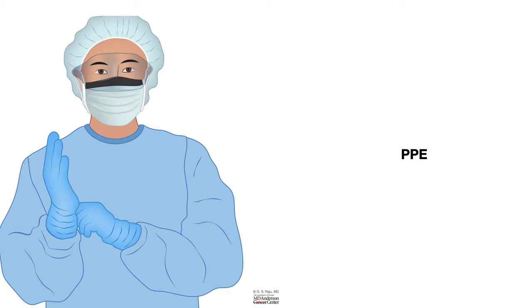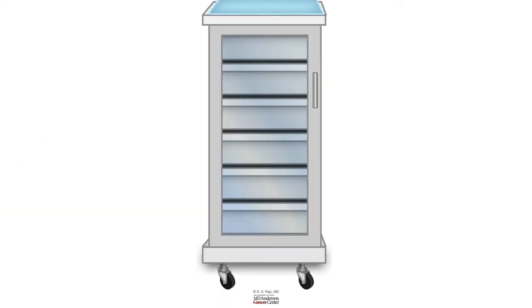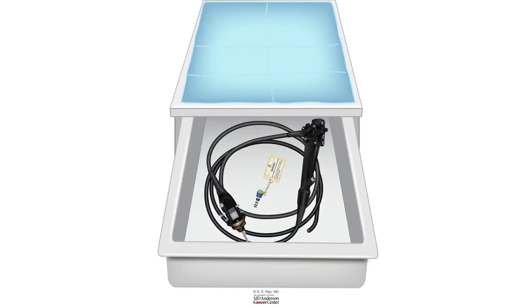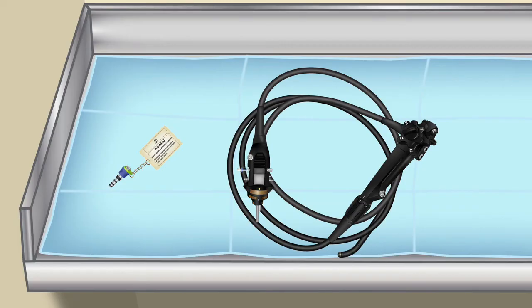So let us go about how we do that. After the endoscope comes out from the high level disinfection unit, it is dried up and placed in a cabinet. You go to the cabinet and remove the endoscope from the storage cabinet, then place it on a clean sheet before you start the process of drying. There are three options for most endoscopy units.